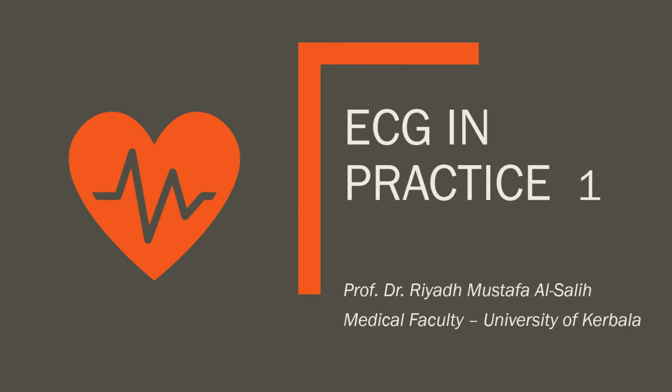Bismillah ar-Rahman ar-Rahim. Our practical lecture will be on ECG in practice, part 1. The objectives of this lecture will be how to read the ECG tracing and how to interpret the ECG.